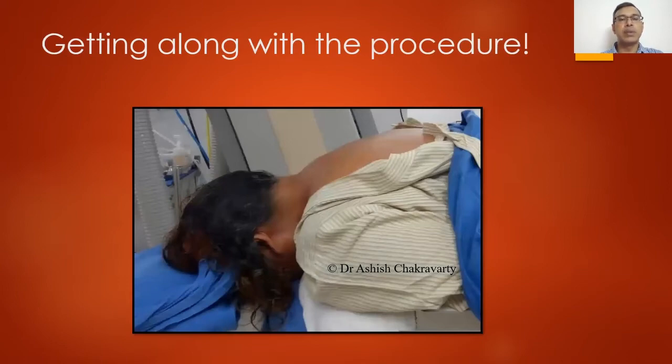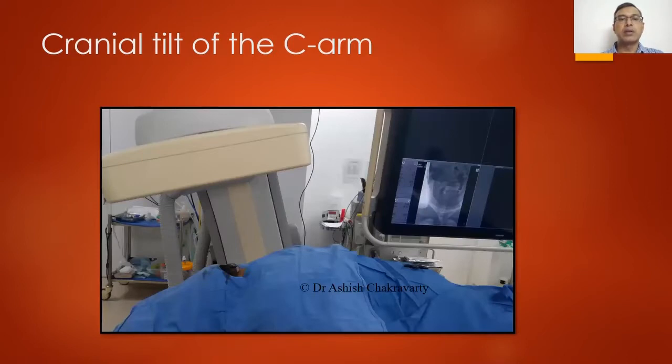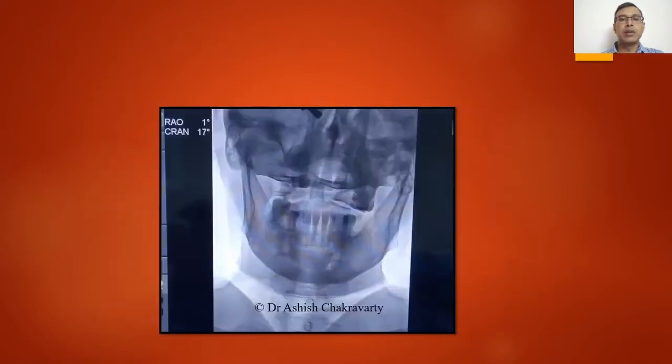So let's get ahead with the procedure. We would want the patient to lie with the head flexed with a pillow under the chest. Having done that, the C-arm is positioned in AP view with a cranial tilt, till the atlantoaxial joint comes in between the two incisors.